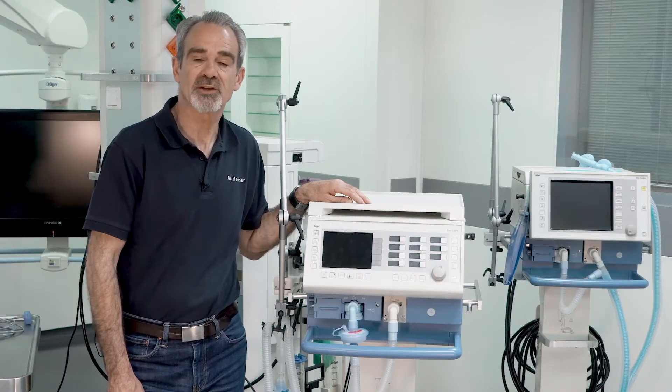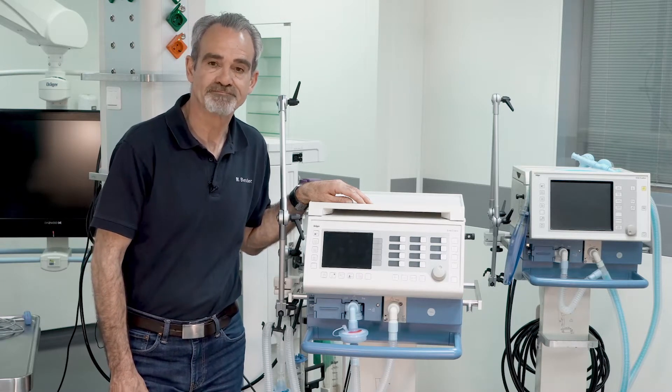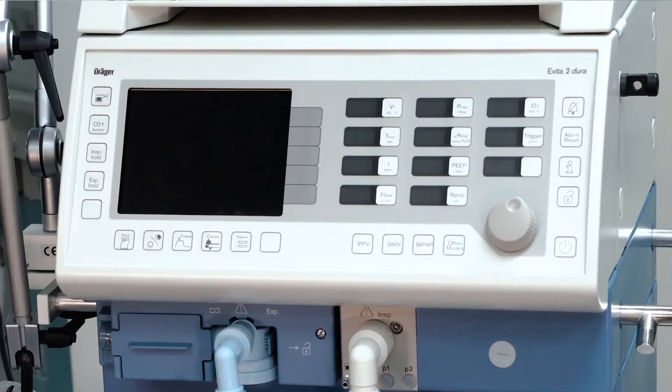In this video, we would like to demonstrate for you the device check of the Avita 2 Dura. After assembling the device, turn the device on with the main switch on the back side of the device.